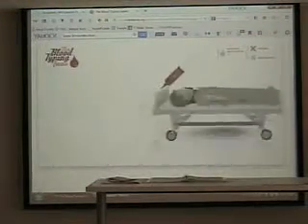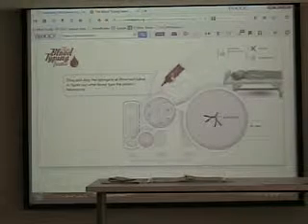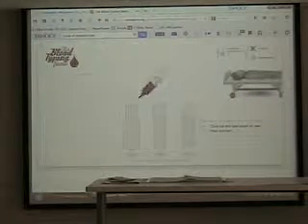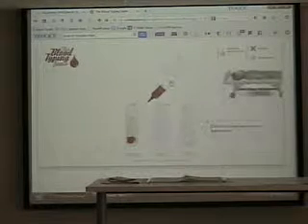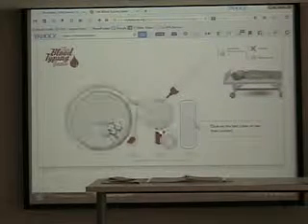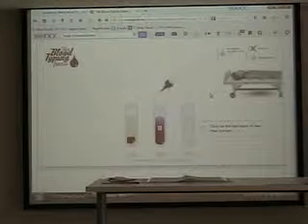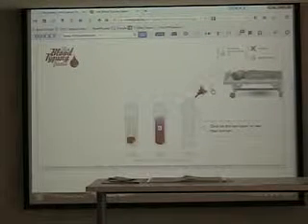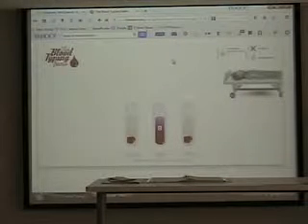All right, then I should grab and put it in the tube. Oh, when you click on the tube, it tells you what's in it. So I click on this tube, what's in it? B antibody. I put my blood in there, shake it. What's in this tube? RH antibody, of course. Oops. Okay. And it shakes it. Alrighty.